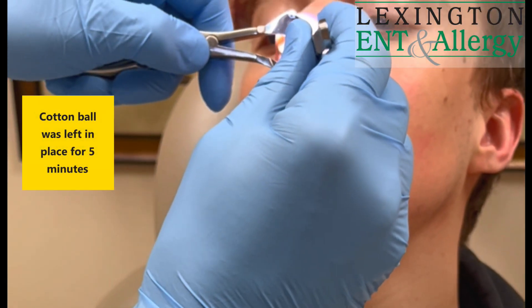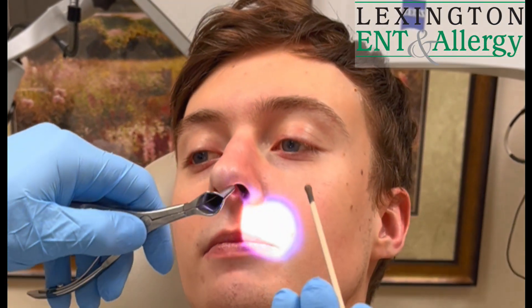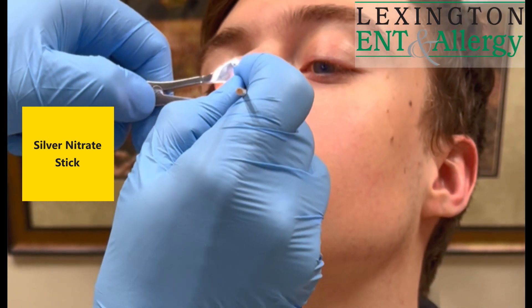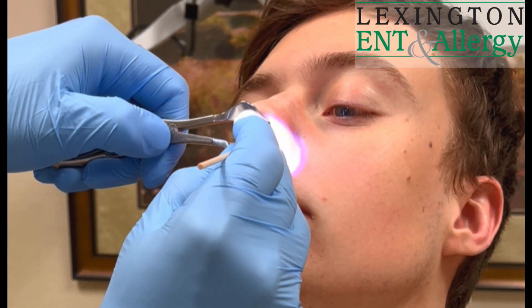I'm just going to get that packing out of the nose. And this is the silver nitrate stick. I'm just going to rub it around those places where the prominent vessels are in the front part of the nose.